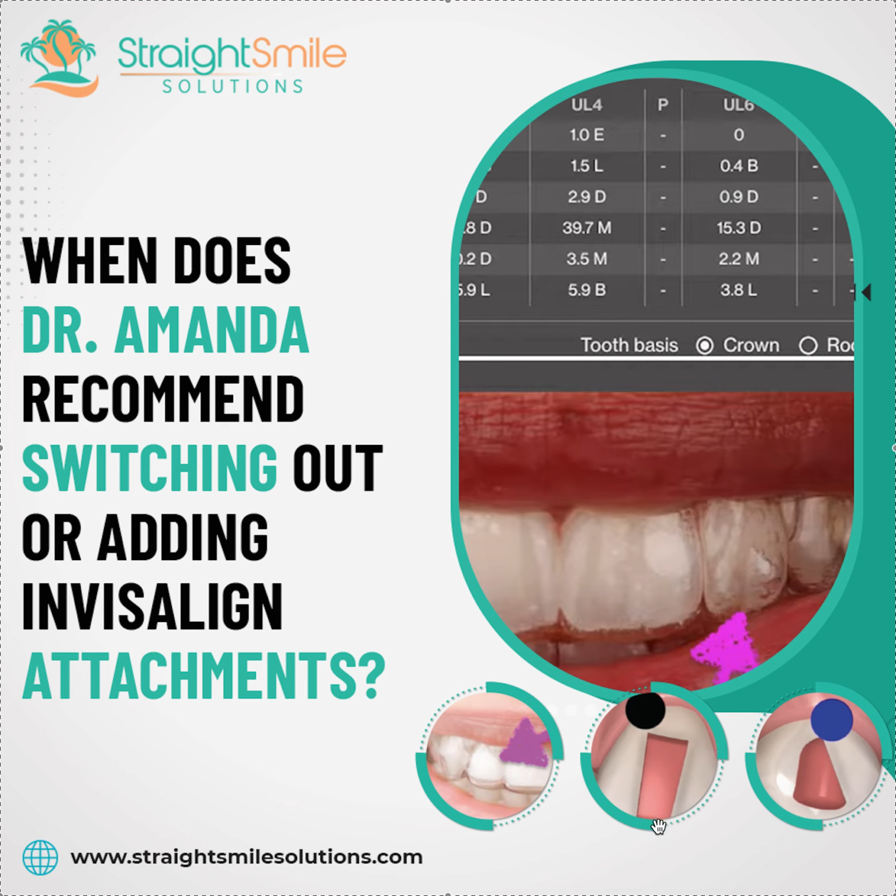Then I ask for the biggest possible attachment. I don't usually tell them what type. I let them decide. You can see here, they gave me a big vertical attachment. Here, they gave a beveled attachment. That's great. Why? Well, because if you have an unpredictable movement, you're going to have tracking issues. So you want to have the biggest possible attachment you can put on there.